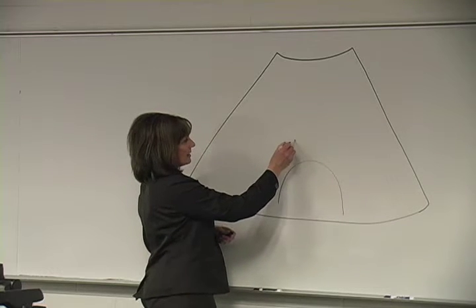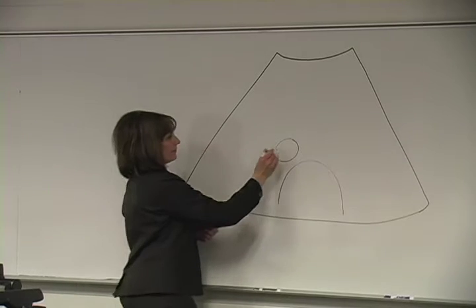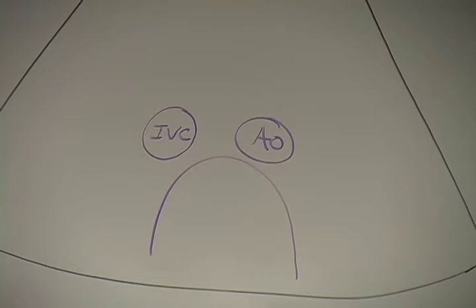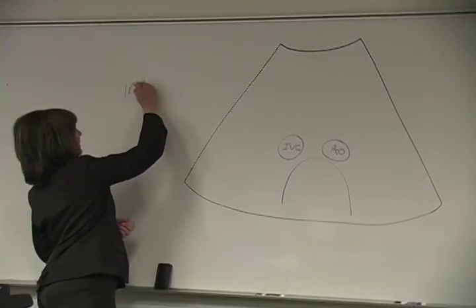Then above that is the IVC. And over to this side is the aorta. Now from the previous lecture, what plane am I scanning in? Transverse, good.